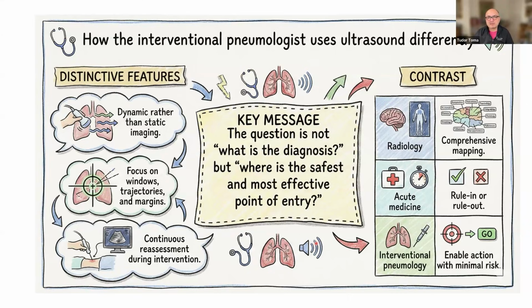So for example, for the diagnosis of pneumothorax, we are using the ultrasound to help with the trajectory of the needles, of the biopsy needles, of the insertion needles. And it's also used as a continuous assessment during the procedures.